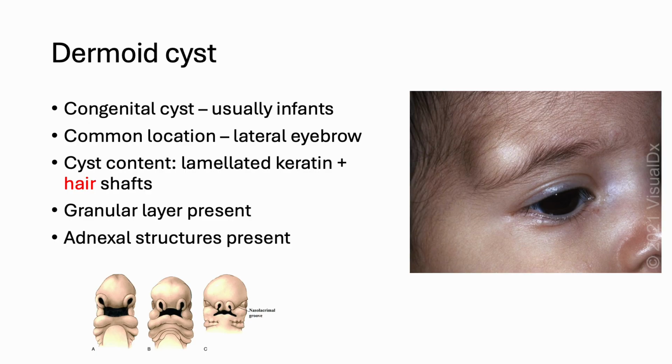The next one is not a very common type of cyst, which is a dermoid cyst. Don't confuse the dermoid cyst with the epidermoid cyst. There is a big difference. And we have the ovarian dermoid cyst. That is something totally different. Don't be confused.